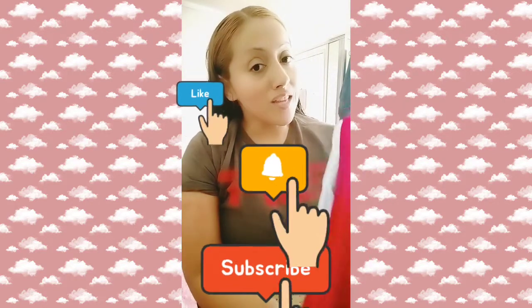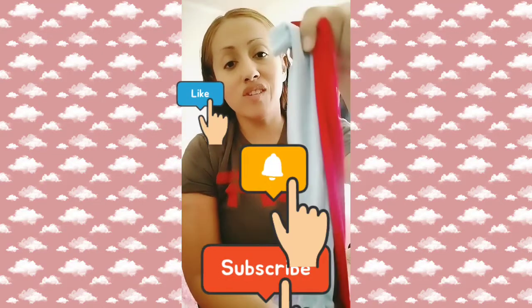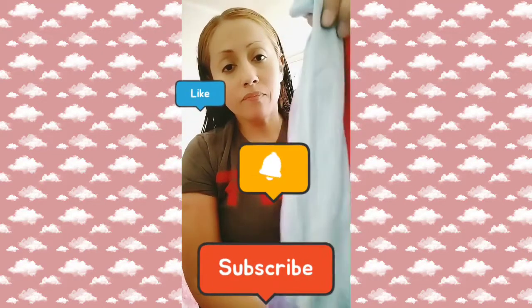In the last video, towards the end, you guys saw these cooling sleeves. This is what I wear under the Sarmiento brace, and they come in every color. Today I'm going to teach you how to put on the cooling sleeve, the Sarmiento brace, and then the Velpo sling — all in this video, so stay with me.